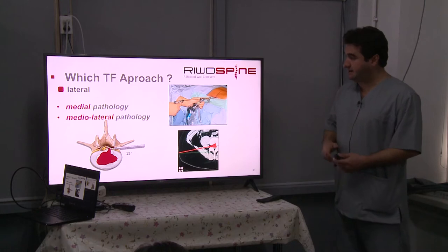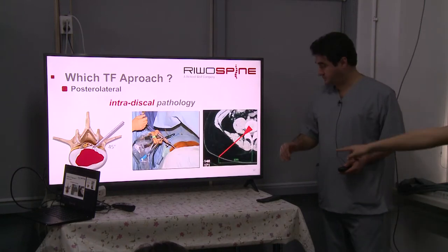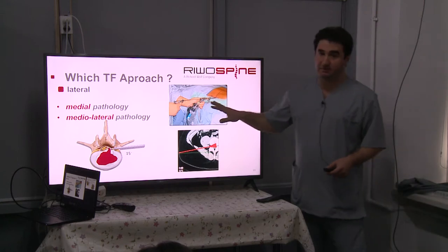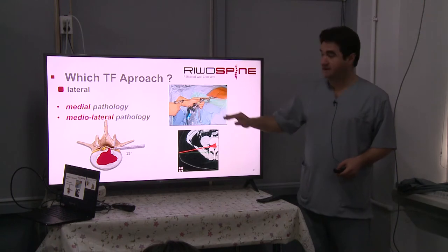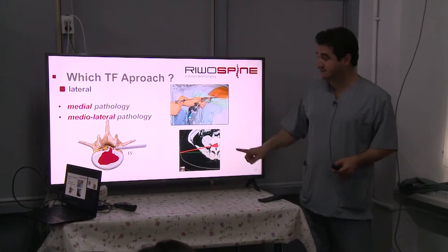And how many centimeters? Usually 8 or 10 centimeters. And now, in 99% of cases when we do a transforaminal approach, we prefer to do the lateral transforaminal approach because of the facet problem to reach the epidural space.